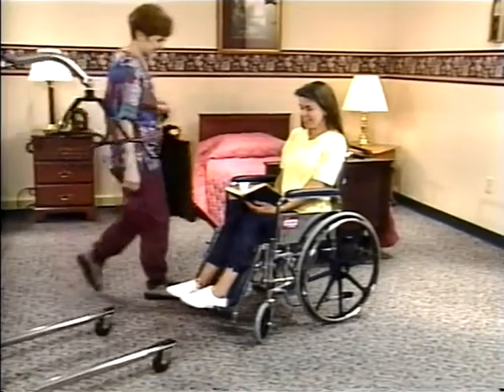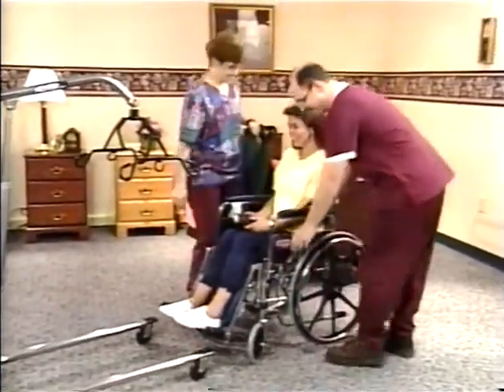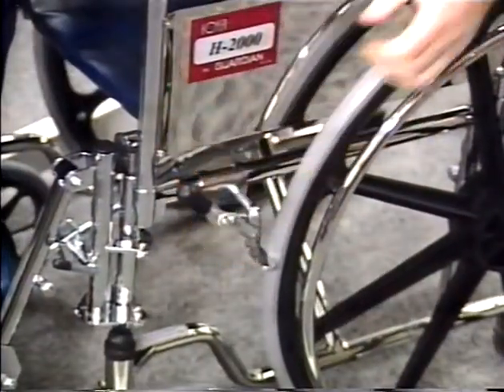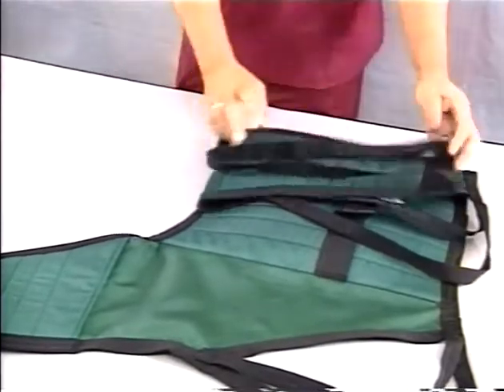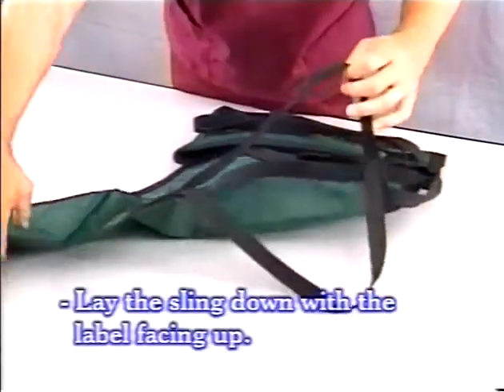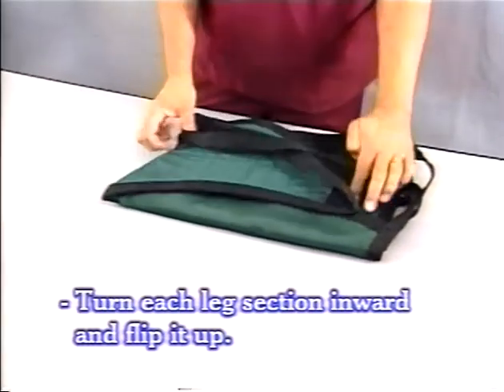While you never lock the casters on your lifter, you always lock the wheels on a wheelchair to ensure stability during a transfer. When installing the Hoyer 4-point sling, fold the sling as shown. Lay the sling down with the label facing up. Turn each leg section inward and flip it up.